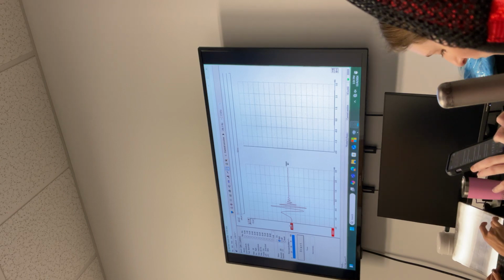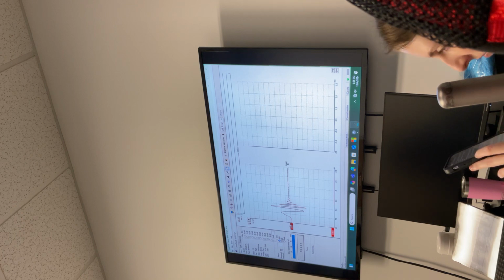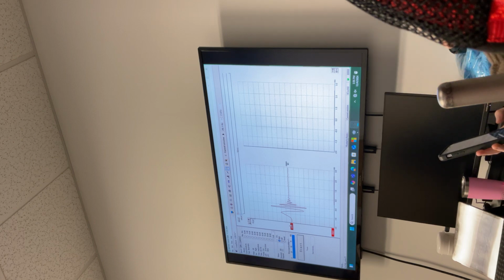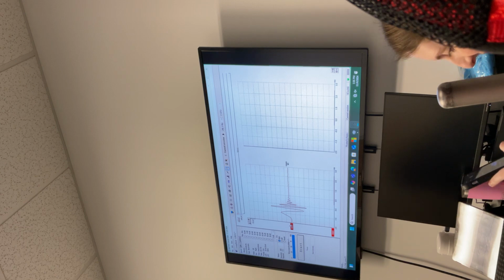So here are the values in your lab document. You can look at it: at 80 dB, the click is 5.36 average. You can see across the broadband chirp, narrowband 4000, 2000, 1500, it's all around 5.3. If you look at 20 dB, click is 7.7, all the chirp is around 8. Across all the narrowband and broadband chirps, latencies are similar to that of the click. They adjusted the 0 point to do that.